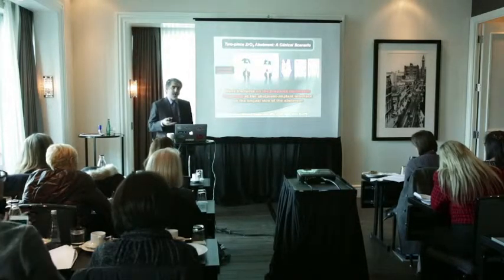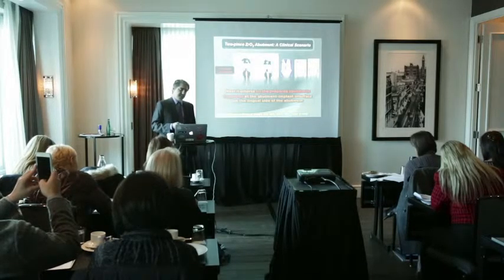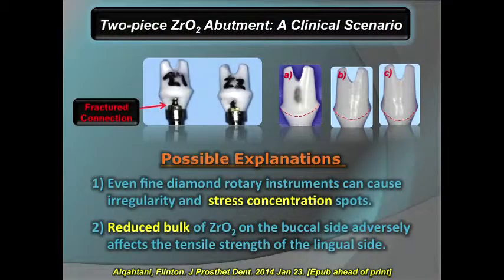It has to be untouched with the thickest possible thickness in the lingual neck, which is the weak spot of our abutments. To explain that, they said that number one is stress concentration. Once they start cutting the abutment, there will be some irregularities and some stress concentration spots. It can cause breakage, and of course the reduced bulk of the zirconia can cause the fracture.